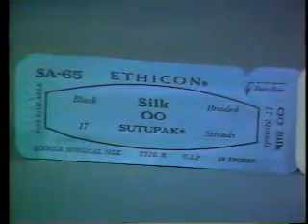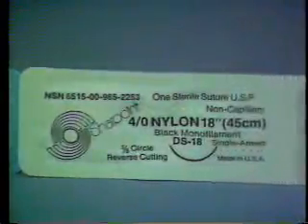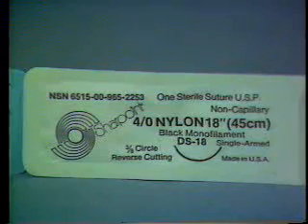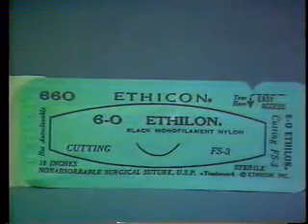Select the proper type and size of suture. Suture for external wounds is either silk or nylon. The suture sizes range from 2/0, which is coarse, to 6/0, which is fine. For cosmetic areas, the finer suture is preferred.